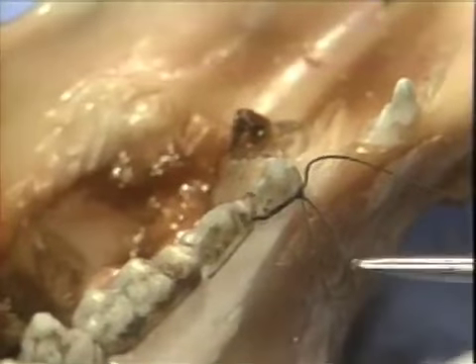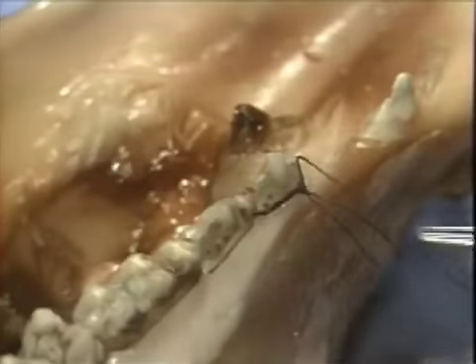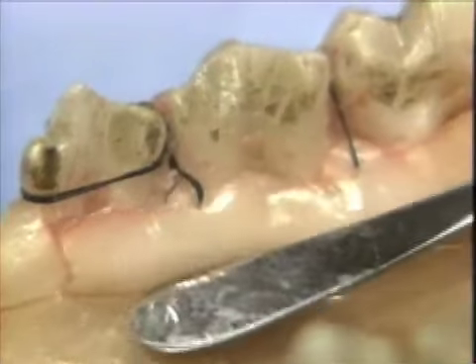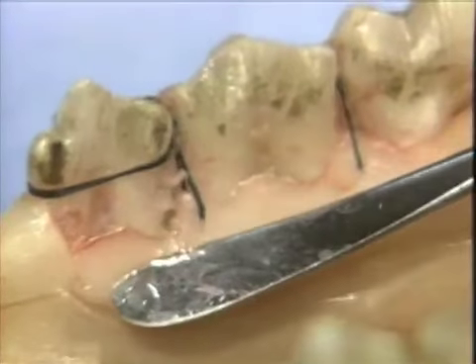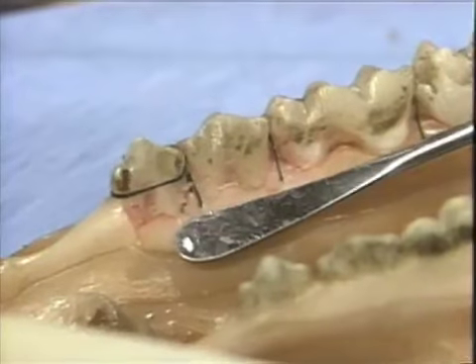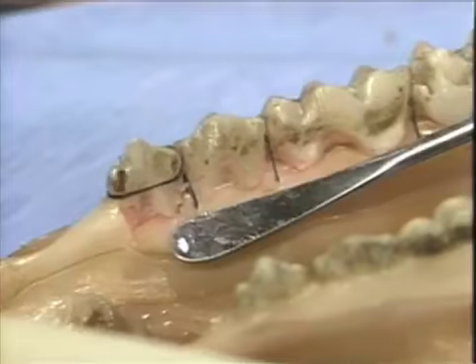The sling suture is ideally suited to the apically positioned flap procedure. As you can see, the sling suture allows the lingual flap to rest at a position apical to its original position along the tooth surface. A periodontal pack will now be placed to secure this tissue at this position.